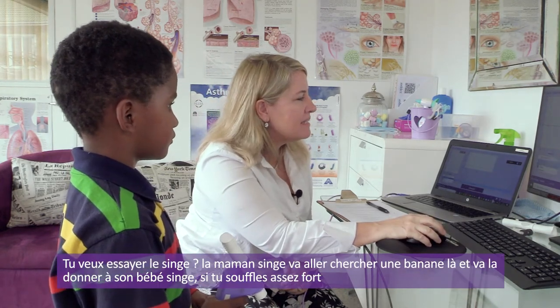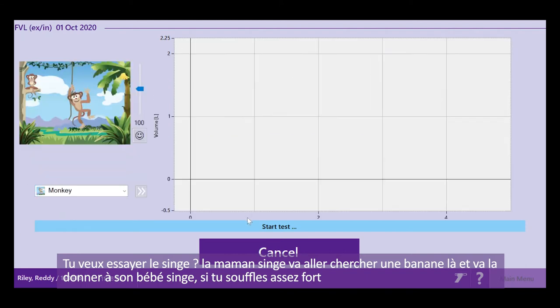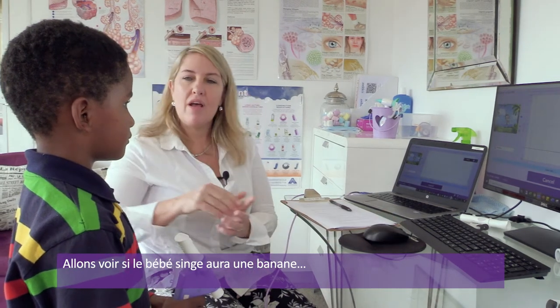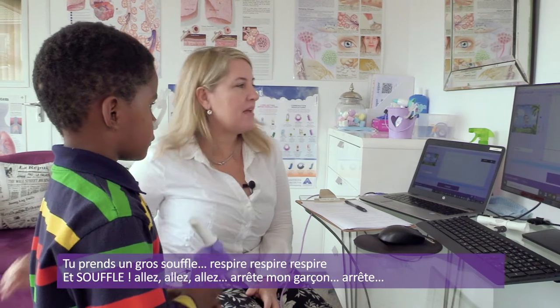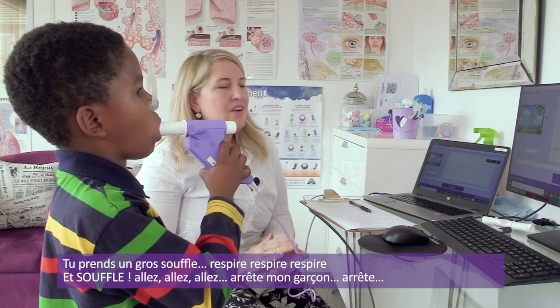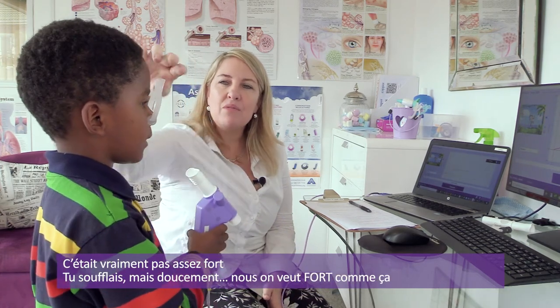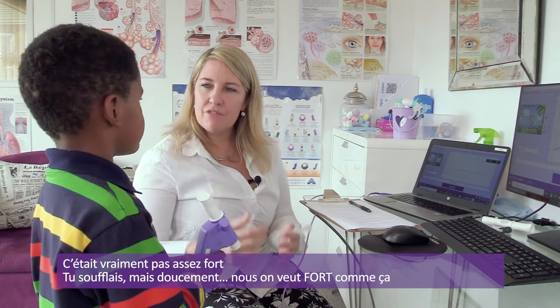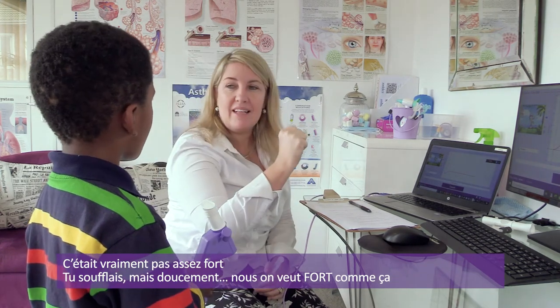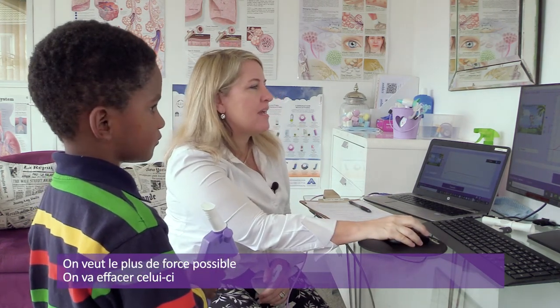All right. Wait, let's give you, do you want to try the monkeys? So on this one, let me just show you, that mommy monkey will go and grab a banana over there and give it to her baby monkey if you blow fast enough, okay? Let's try and see if you can get the mommy to give the baby a banana. Okay, nice big one, big. Fast as you can, blow. Okay, go. Okay, stop my boy. Okay, stop. Okay, that one was a little bit too slow. Okay, did you feel, so you were blowing, but you blew, what we want is like that. Okay, so we want you to blow as fast as you can.